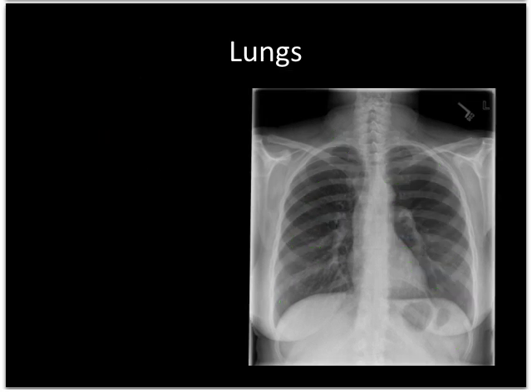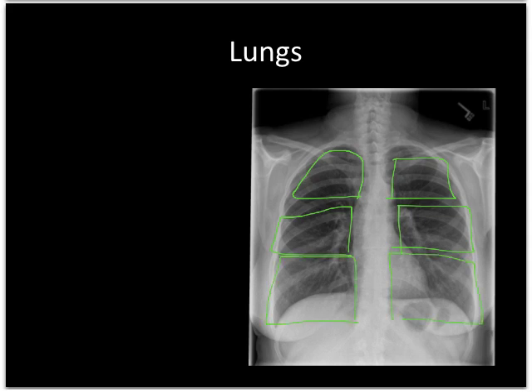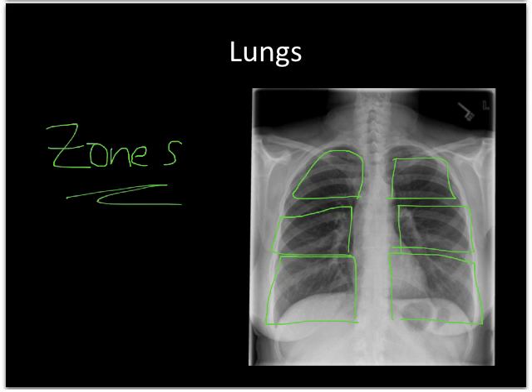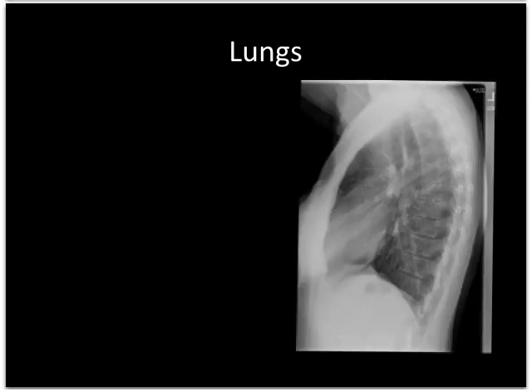Before I leave the lung parenchyma, I want to compare the zones of both lungs — the upper zones left and right, middle zones left and right. These should be very symmetrical, and sometimes just doing that comparison at the end will help you spot an additional abnormality. I then turn my attention to the lateral study, doing the same sweep of the lung parenchyma as on the PA study and looking for the same abnormalities.